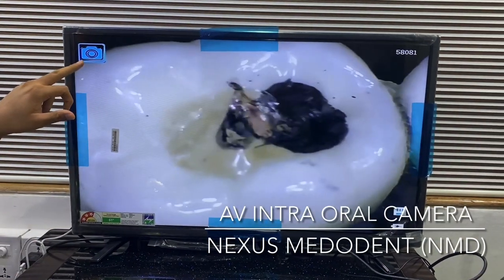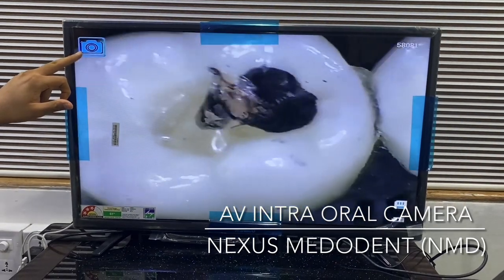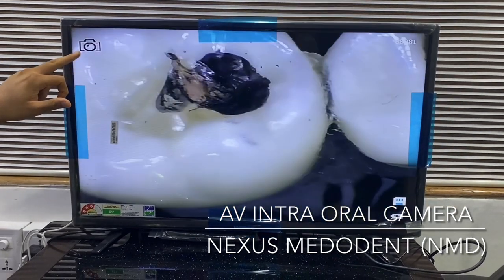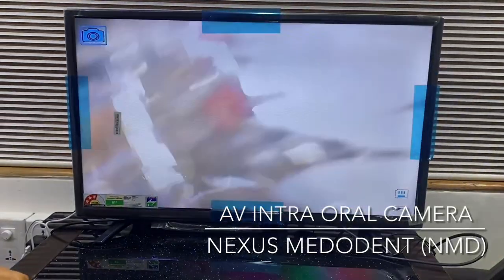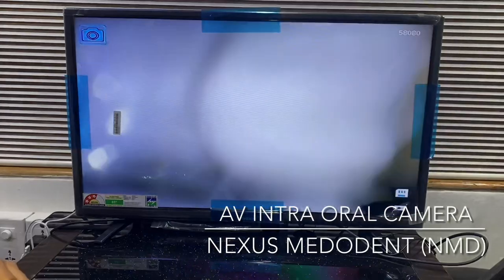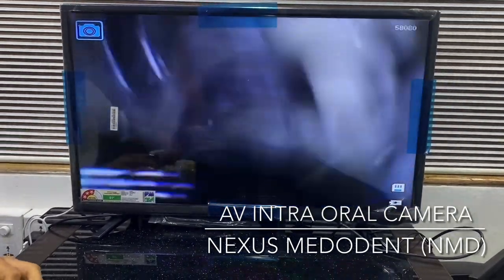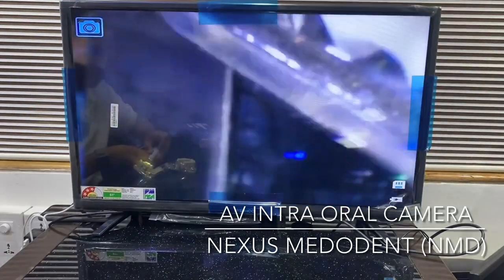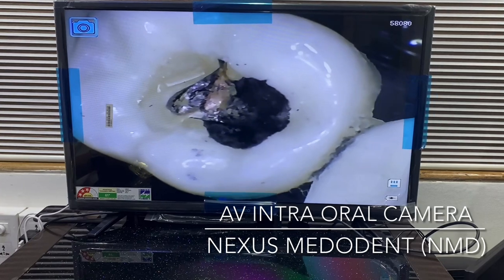Let me capture a few more pictures to show you — there you go, captured again. Very, very clear image quality.